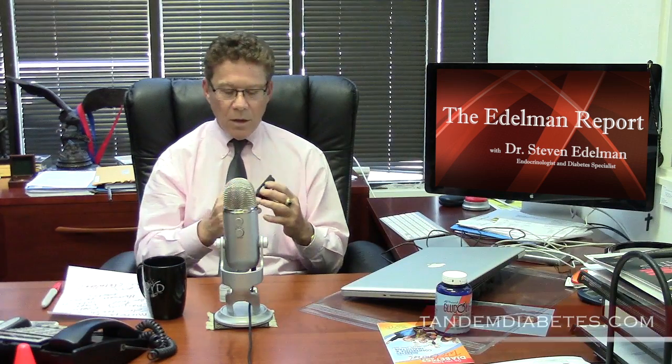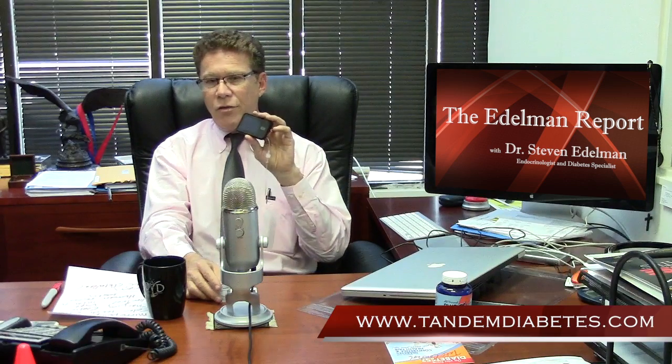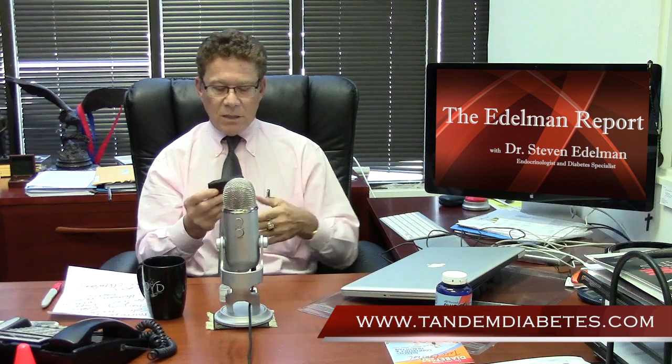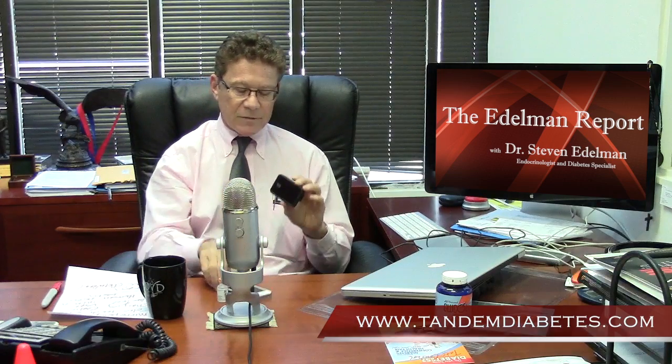This pump is extremely advanced. First of all, it has a micro pump processor inside, and although a third smaller than most other pumps on the market, you can see with the holder it's pretty small — the size of a very small iPhone — and it holds 300 units of insulin. The insulin cartridge is actually like a paper baggie, like a water balloon that you fill up, so it doesn't take up too much space and still holds lots of insulin.